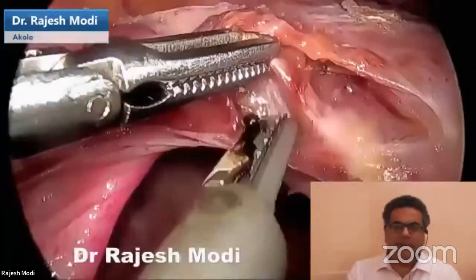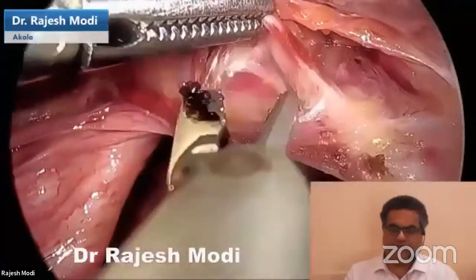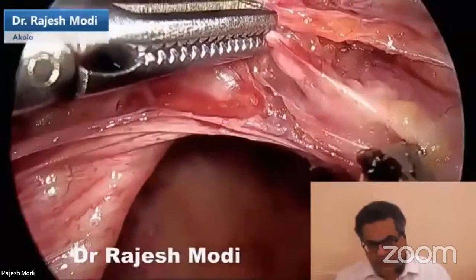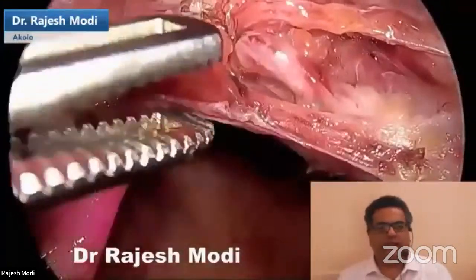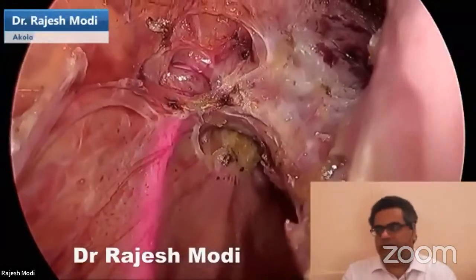You realize that you are really, really far away from the ureter in any benign gynec hysterectomy. This is, I am holding the uterine. I told you, do not be worried about the uterine. It is a strong, muscular, surgeon-friendly structure. The vein, on the other hand, is engorged.